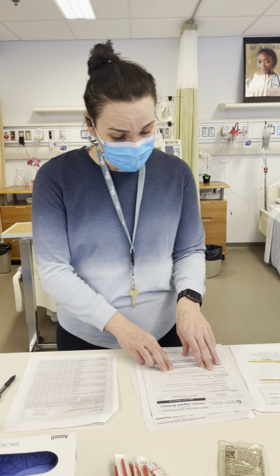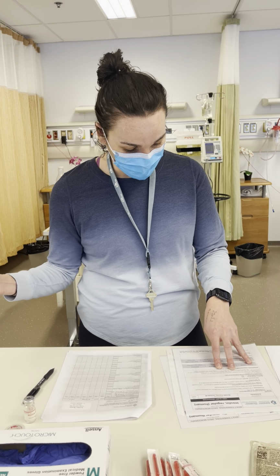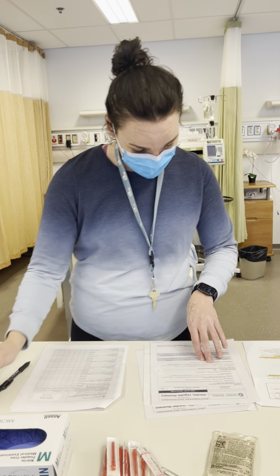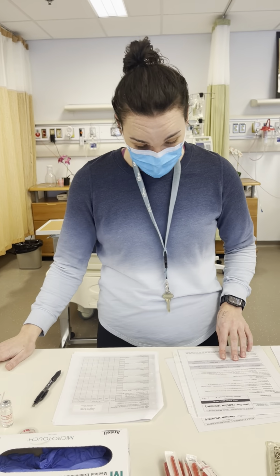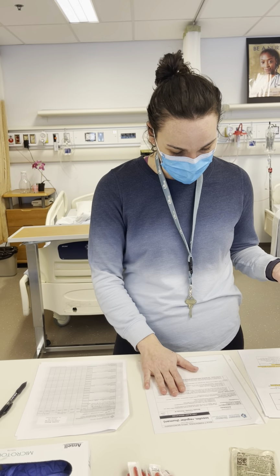IV continuous, it says we have to add 100 units, and we'll use our 3 milliliter syringe with our blunt fill needle and draw up 1 milliliter of 100 units per milliliter insulin. So that's this. And we're going to inject the 1 milliliter into our mini bag, which is 100 milliliters of normal saline, and we will double check the compatibility. Normal saline is compatible, so that's good.